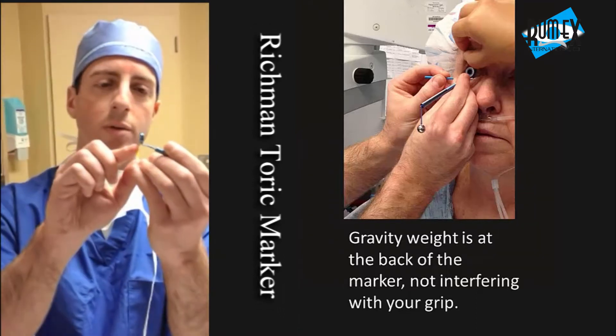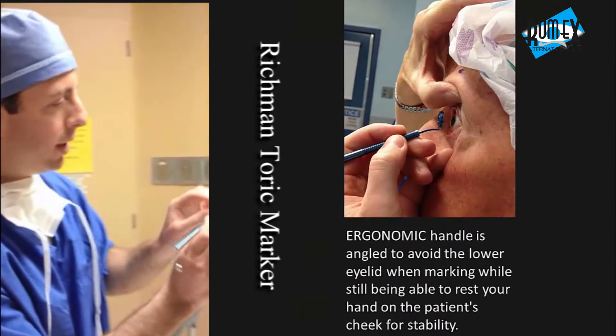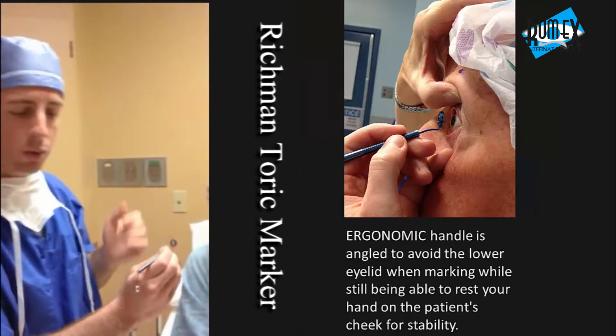The second modification was a change to the angulation that comes off the actual face of the marker. I used to have trouble coming through and hitting the patient's lower eyelid, which I found quite challenging.